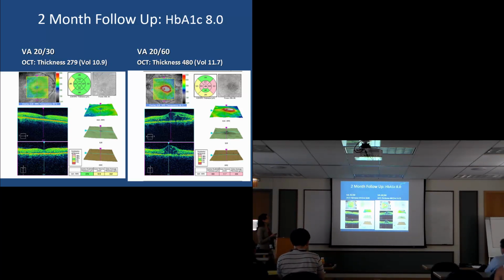And her vision, unfortunately, can stay stable even if the edema goes away. One thing we need in diabetes is to know what's the most sensitive marker of all this information on the map. Sometimes people try to rely just on the thickness in the central subfield, which is right here. But some investigators in LA, my mentor, really feel the volume measurements are more important.